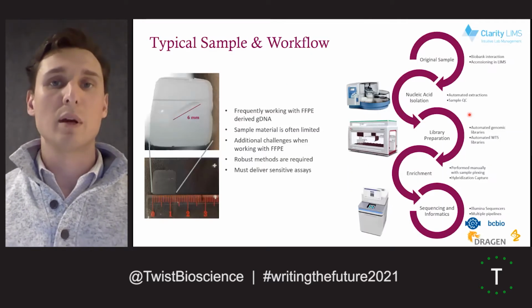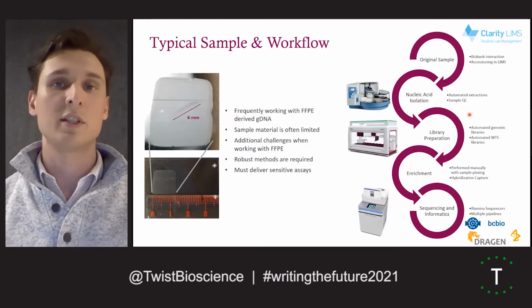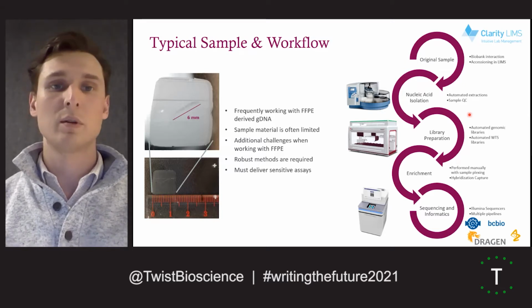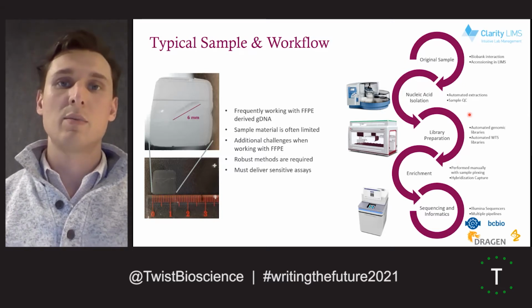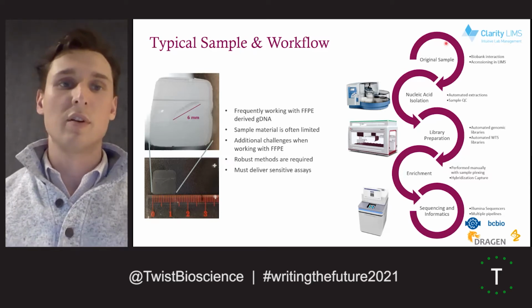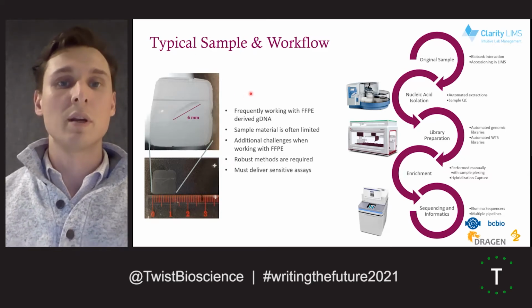So to orient you to what the typical sample is that we're working with, it's usually FFPE tissue material, and the material is often quite limited. As you can see, here's an example of a very small core needle biopsy.